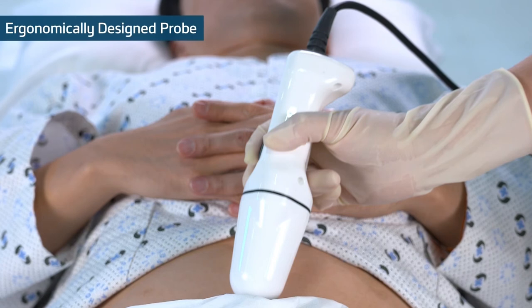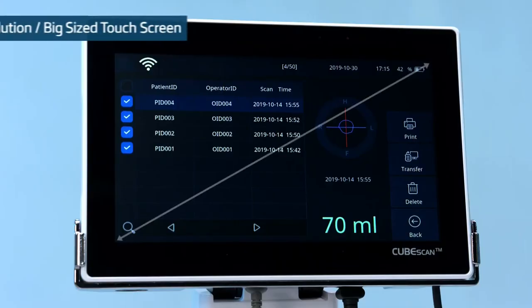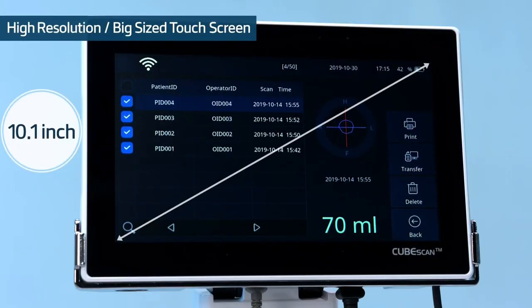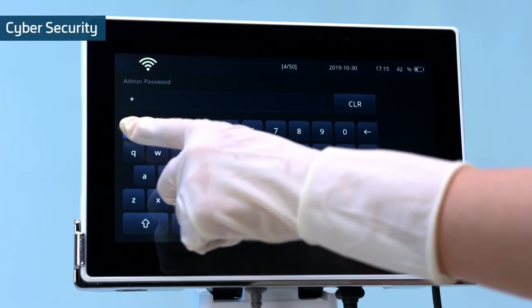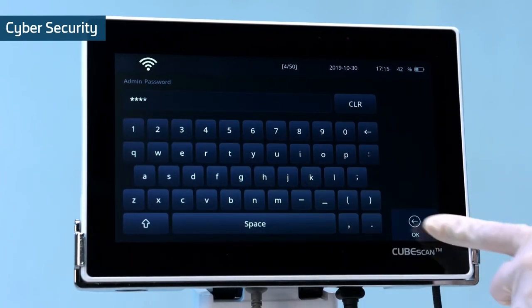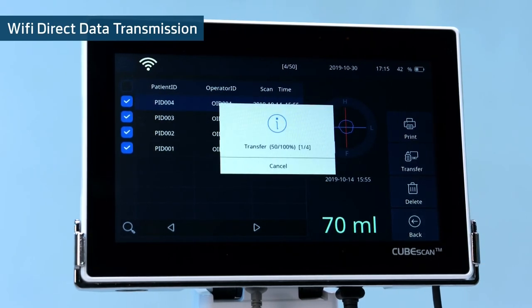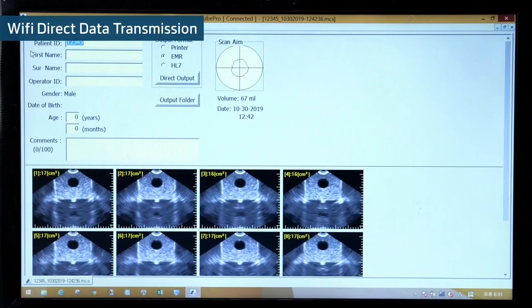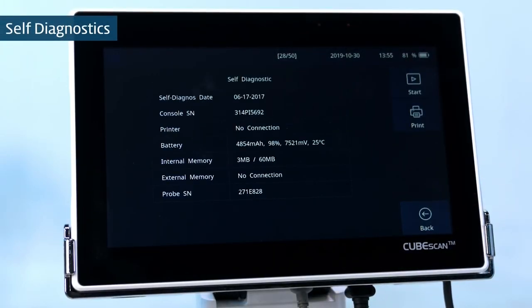The ergonomically designed probe provides a stable grip, reducing the risk of dropping. The high-resolution, big-sized screen provides premium-grade optimal usability. Cyber security: saved patient data can be secured by locking the data review. Wi-Fi direct data transmission makes it easier to manage patient data and transfer it to the EMR system. Self-diagnostics saves maintenance time and cost through detailed device management.